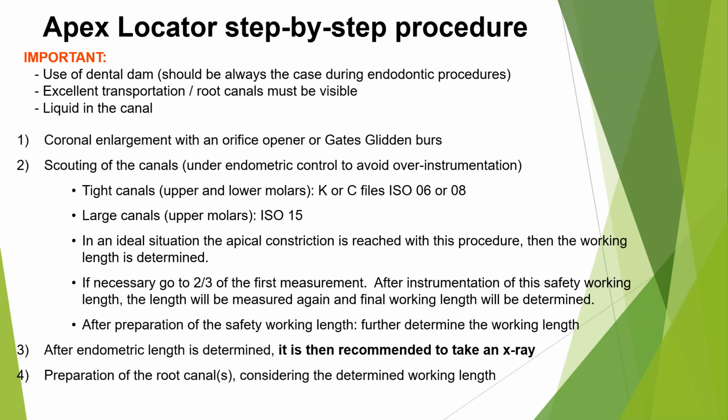Okay. All right, good. And then last thing, I think Gray hit on this as well, is you unplug the lip clip from the apex locator between teeth.